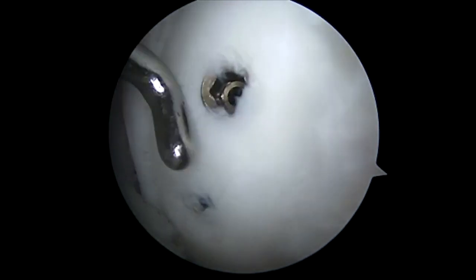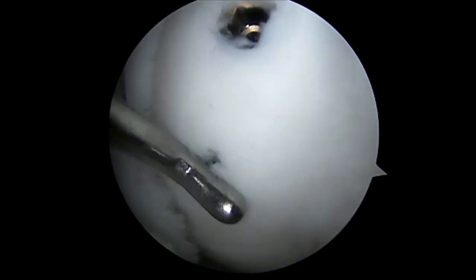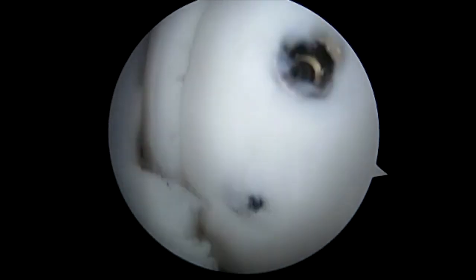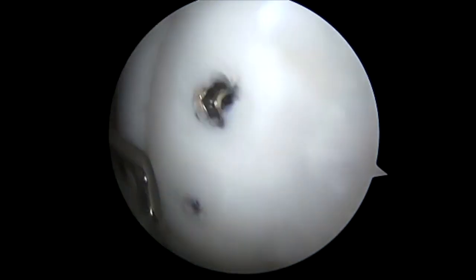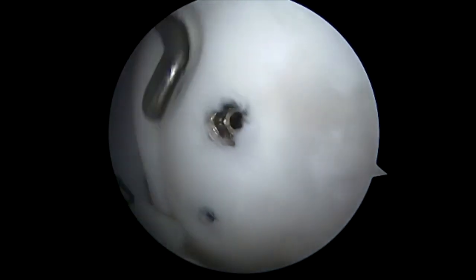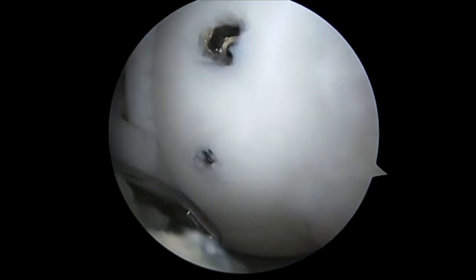As you can see here, we probe to make sure there are no palpable screw heads. Furthermore, you can see the compression of the fragment, and that it is not moving on palpation.